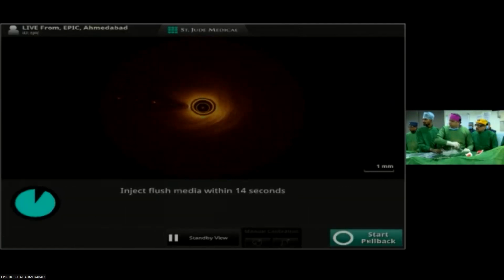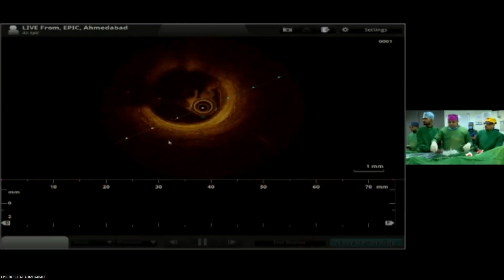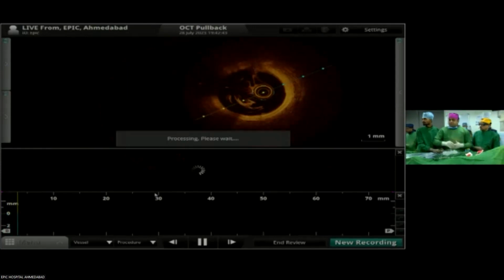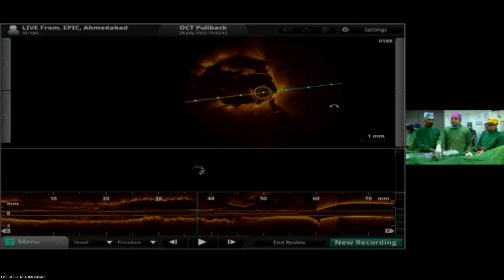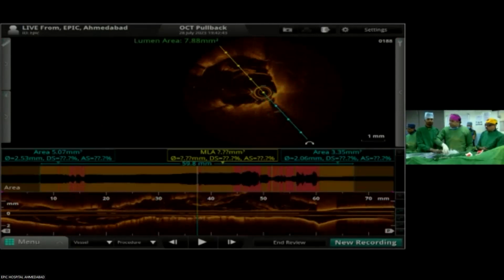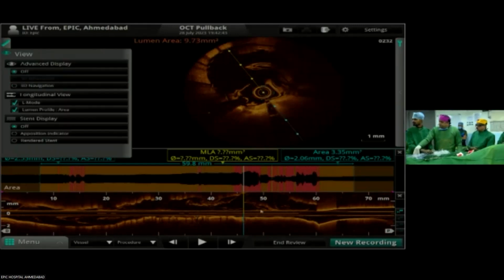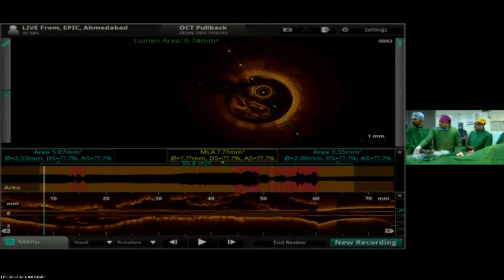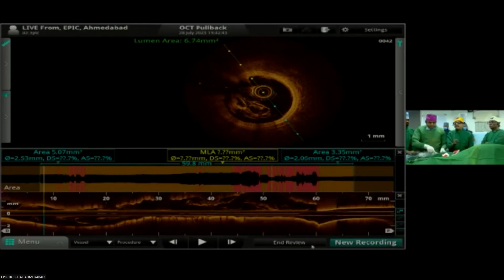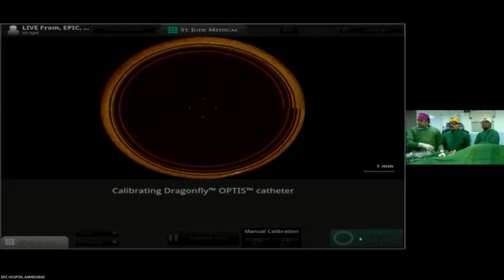From the audience: Actually, I just wanted to understand. Dr. Gupta, normally practice has been the crossover. I don't see any harm in doing a crossover. Do you have any negatives compared to doing the ostial stenting, which requires so many manipulations, so many angles, and still there is a risk that you may have a geographical miss because of the stent or the other regions? Whereas when you have a crossover, I don't see any harm. I don't see the type of ostium you have, circumflex, the left main, which is so roomy. Practically 0% chance of any complications doing the crossover.